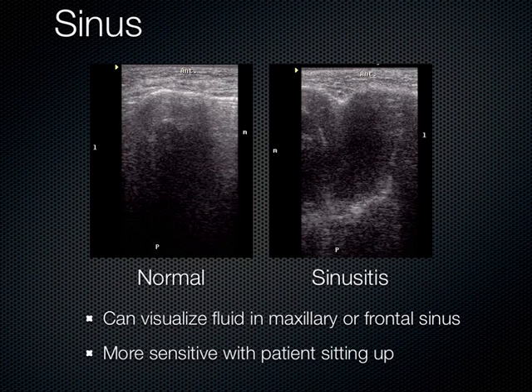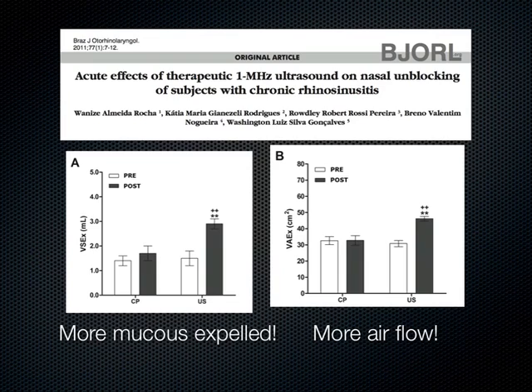It's easier to do this when the patient's sitting up. And actually, there are some therapeutic effects of low-frequency ultrasound on nasal unblocking in patients who have chronic sinusitis. With ultrasound, there's more mucus being expelled, and there's also more airflow after the patient gets ultrasound of their sinus. So I don't know how accurate this is. It was published somewhat recently, in 2011.